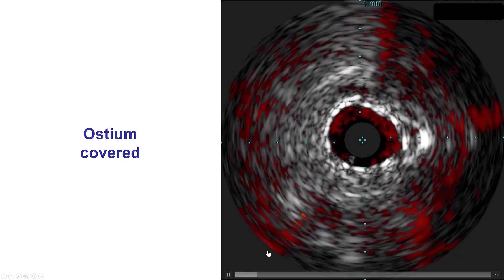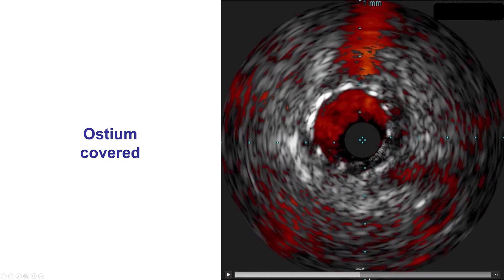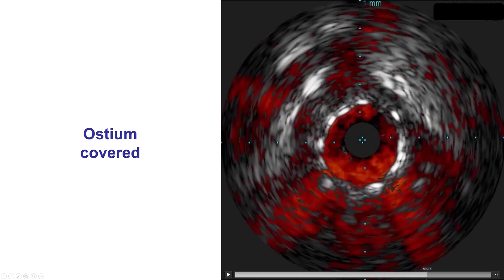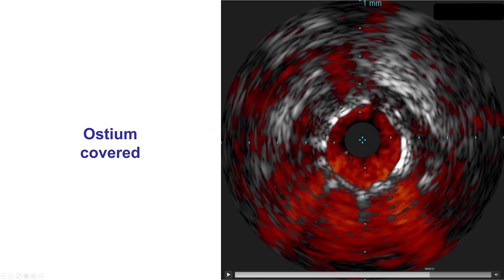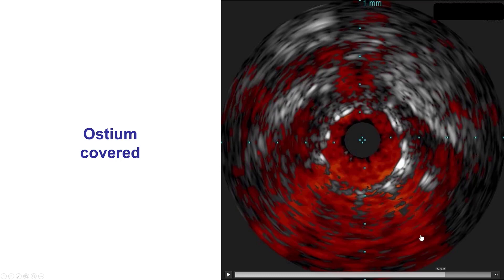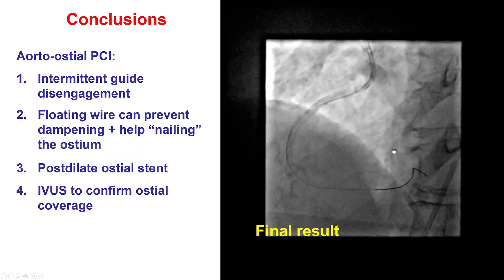For aorto-osteal lesions it is critical to do IVUS to ensure that the stent comes all the way out. We see here that the stent is well expanded and now, coming close to the ostium, we can clearly see that the stent is protruding into the aorta. There is blood flow on the inside and outside the stent, so we have clearly covered the ostium of the right coronary artery adequately. IVUS is critical in confirming good ostial coverage, which is the case in this particular patient.